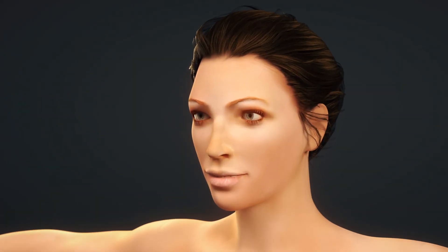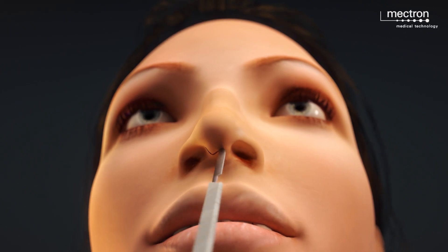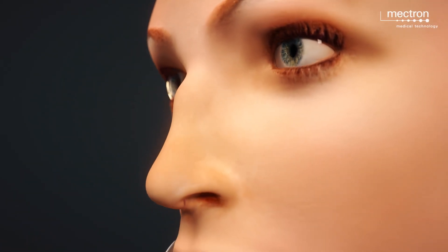Piezo surgery is an excellent tool when refining the bony structure of the nose using the open technique, especially when it comes to gentle preservation rhinoplasty.